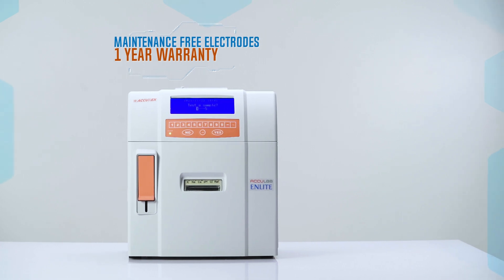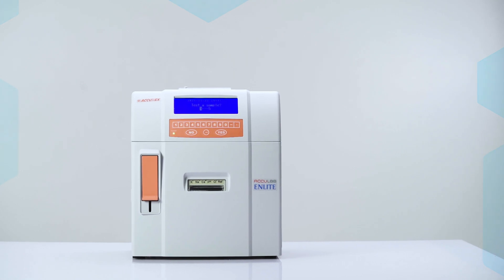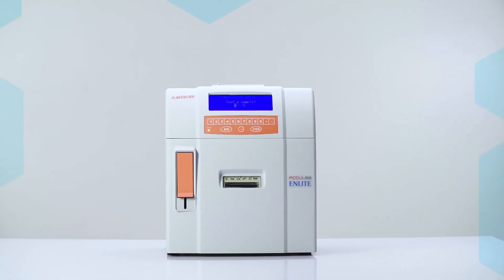Equipped with maintenance-free electrodes with a 1-year warranty, Acurex Aculab N-Lite is a truly maintenance-free analyzer.